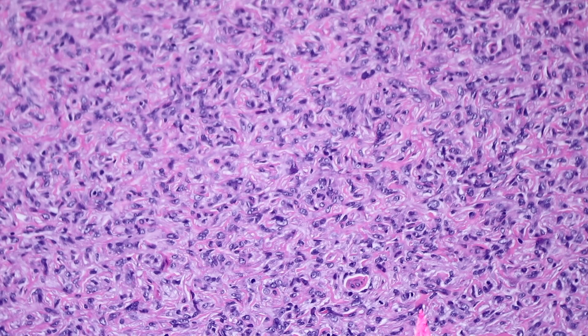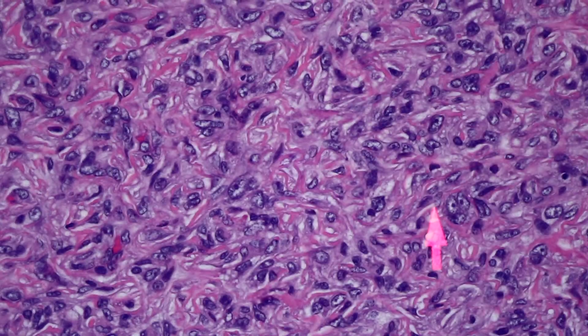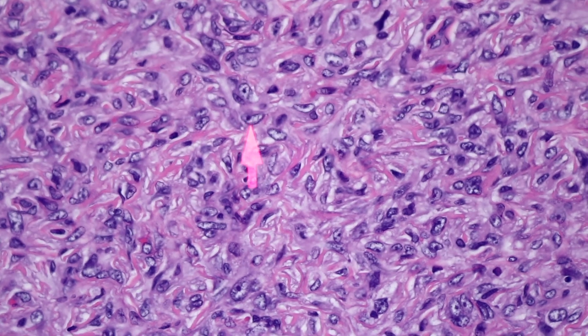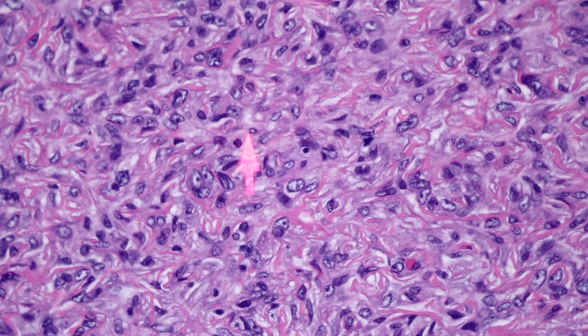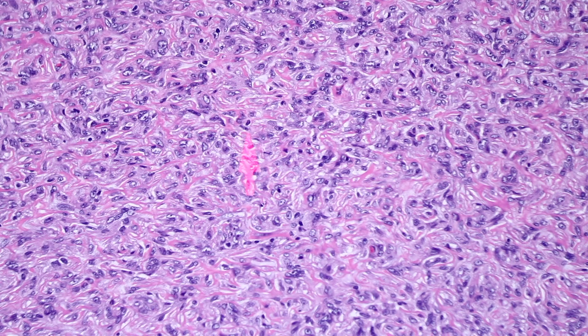If you just look at this at high power, unless you have some experience, you might struggle and say it's a cellular sheet of cells, some of them large and plump and maybe even a little pleomorphic. At higher power you could argue some cells are atypical - they've got nucleoli, big nuclei, vesicular open chromatin. But you can have big hyperchromatic pleomorphic cells scattered in a Dermatofibroma - no problem. Scattered mitotic figures are a common finding, particularly in larger Dermatofibromas.